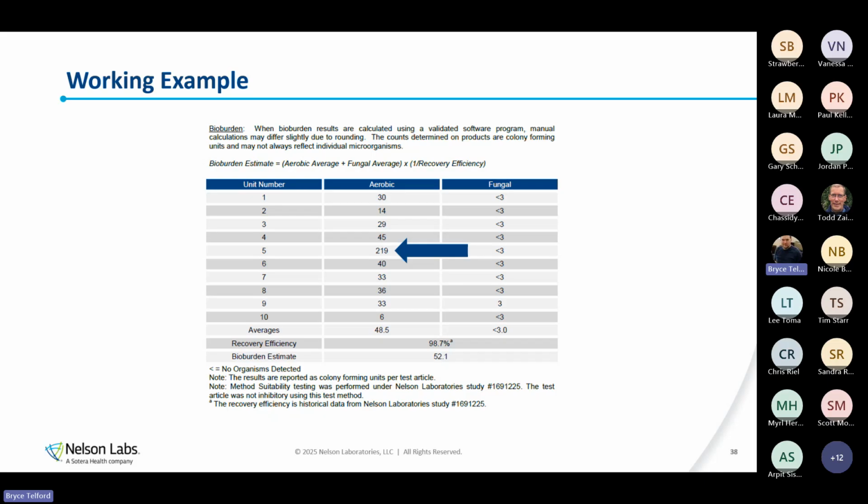But we then have that verification dose experiment, that test of sterility, that is going to directly challenge it. And if that fails, then we definitely have a problem. If that passes, well, sterilization's okay. Sterilization's accepted. Let's take a look at the bioburden and see what we need to do to get it back under control before it's no longer okay. So we do have this one here that is a spike showing up in the actual data that I was shown, so I thought it was good to show.